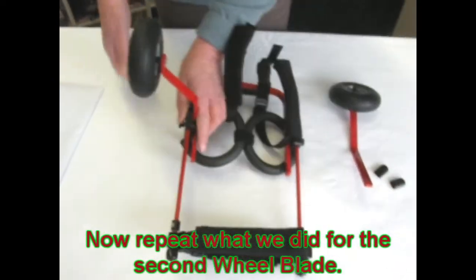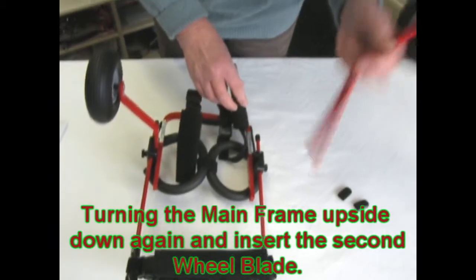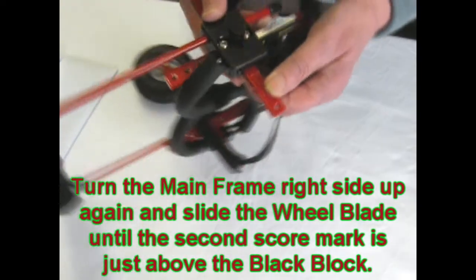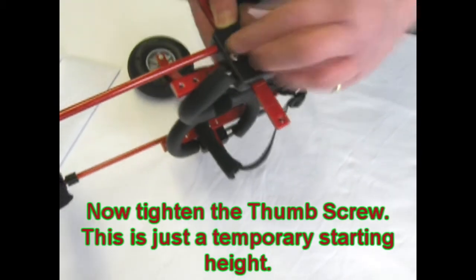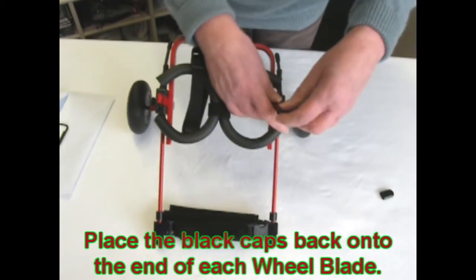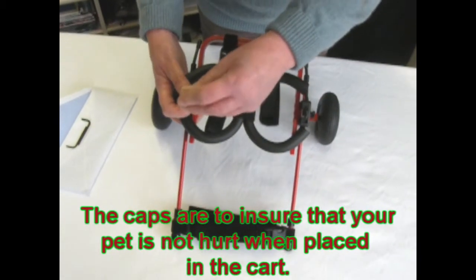Now do the same thing with the other side. Turning the frame upside down, take your wheelblade and insert it into the block. Turn the frame over and put it to the second score mark, then tighten with the thumb screw. Take your little black caps and put them on top of the wheelblades — this is to ensure your pet will not be hurt when placing it into the cart.